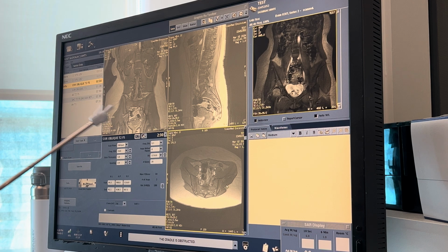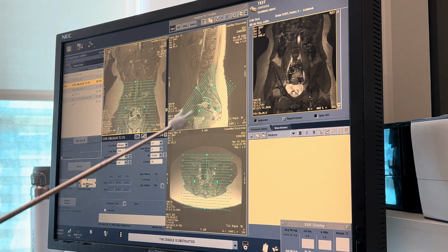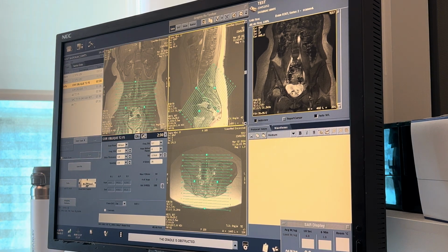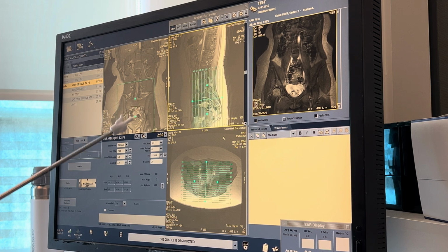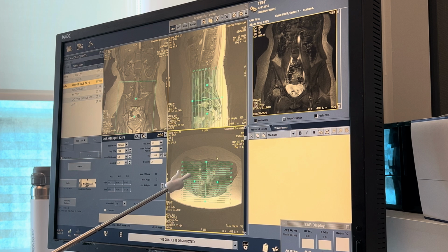Okay, so whenever you're ready, we're going to drop our FOV right here. Perfect. And we don't have an FOV because they're obliqued. So what I want you to do is angle these so that they're vertical, straight up and down. And now the slices are facing anterior and posterior, so we have our FOV. So let's angle these dots with the spinal canal. Perfect. Down here we can angle with the anterior aspects of the SI joints, or you could angle with the spinous process, whatever works.